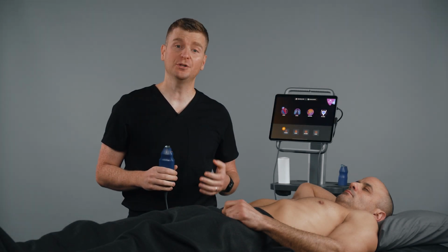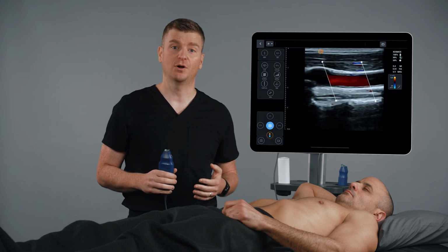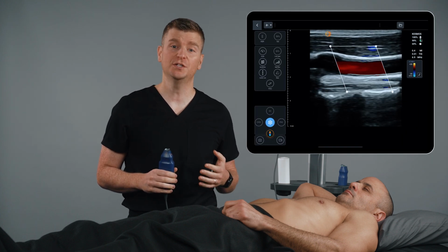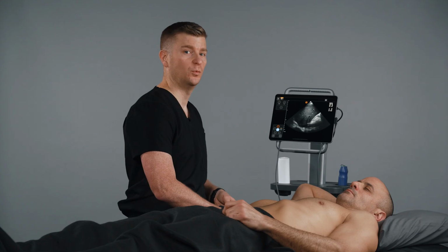I'm going to show you how to use Color Doppler on your Kosmos system. Color Doppler, also referred to as color, helps you visualize blood flow direction and velocity. We have color on both Torso-One probe and the Lexsa probe. Here I'm using the Torso-One to demonstrate on the hepatic vein.